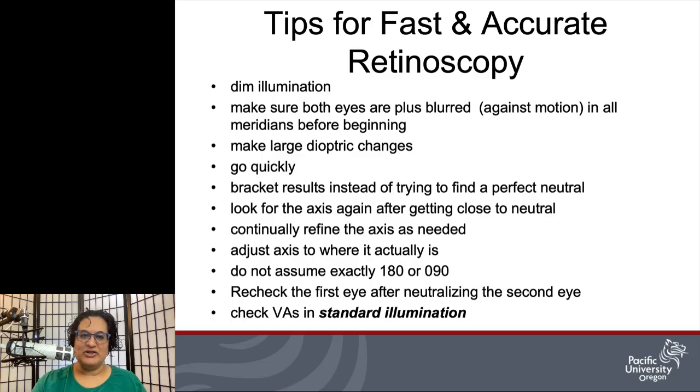Remember that we as graders are going to be checking your retinoscopy during the proficiency. That will hopefully take us less than a minute, but you do need to account for that time in your preparations, that it will take us 30 to 60 seconds to step in, check your retinoscopy, and then let you continue. The sphere windows will be covered, so you won't be able to see the value in the sphere while you're doing retinoscopy. Once you've completed retinoscopy, you can go ahead and remove the covers and record your values. Once you've removed those or checked VAs, you will not be able to repeat retinoscopy for points.